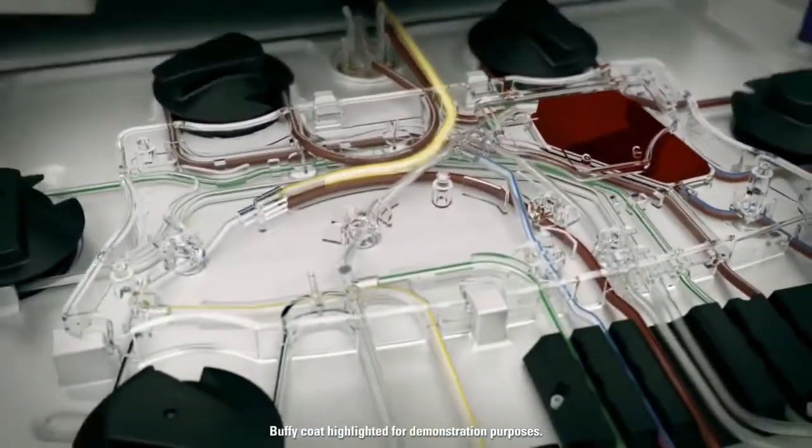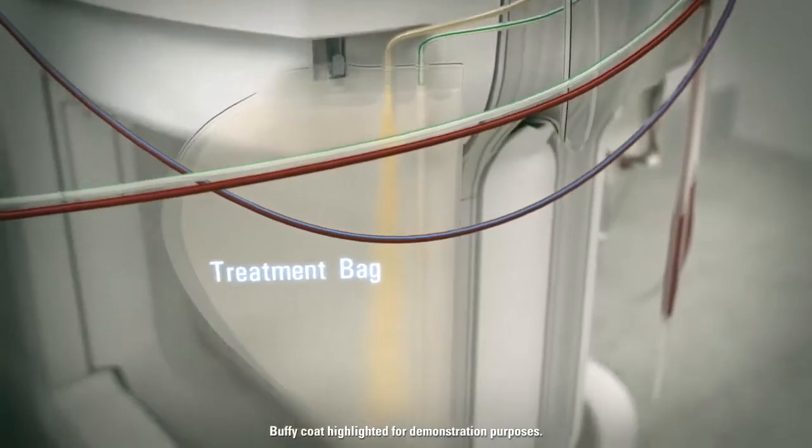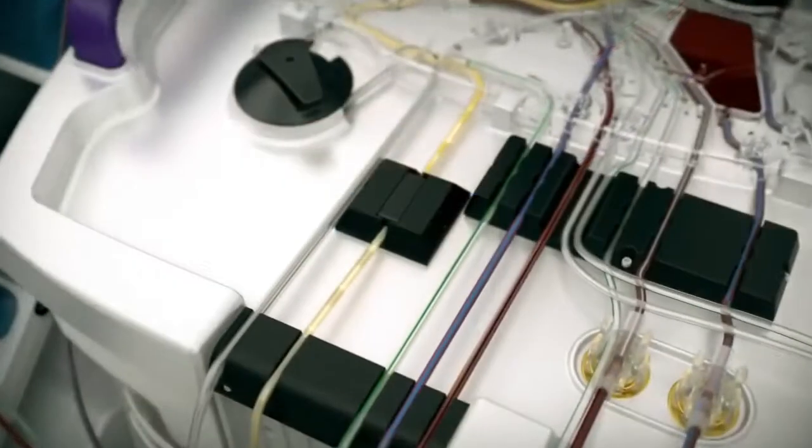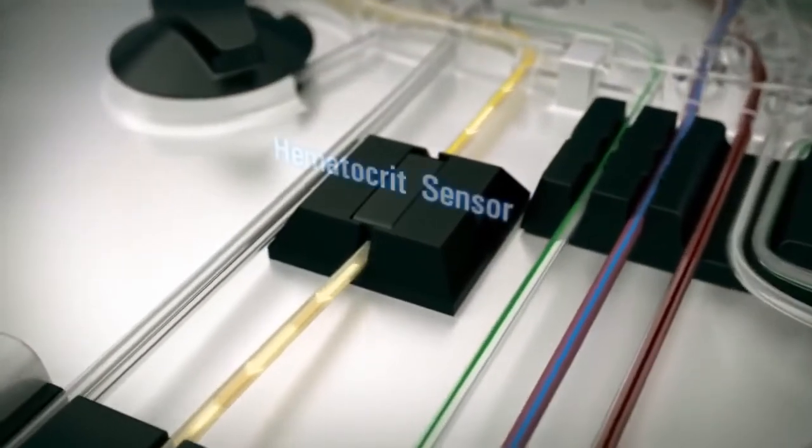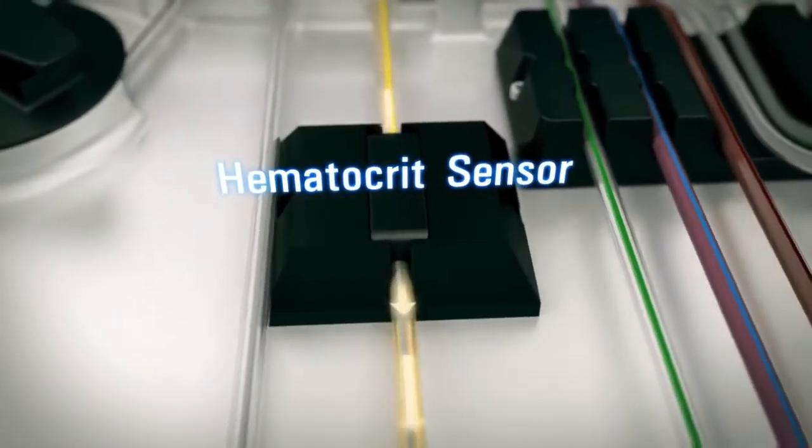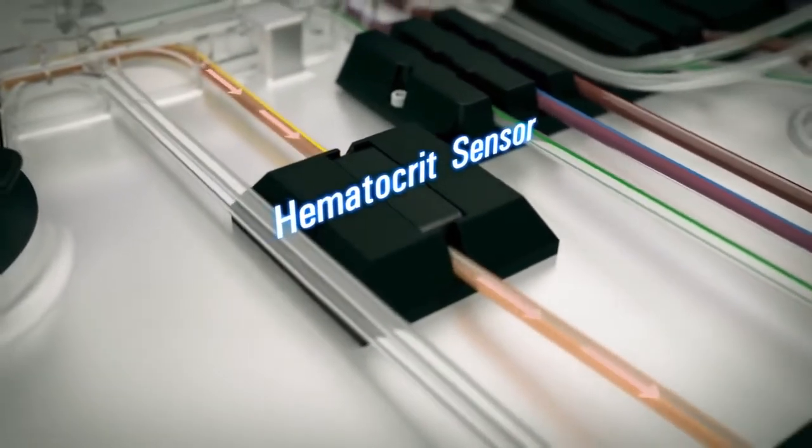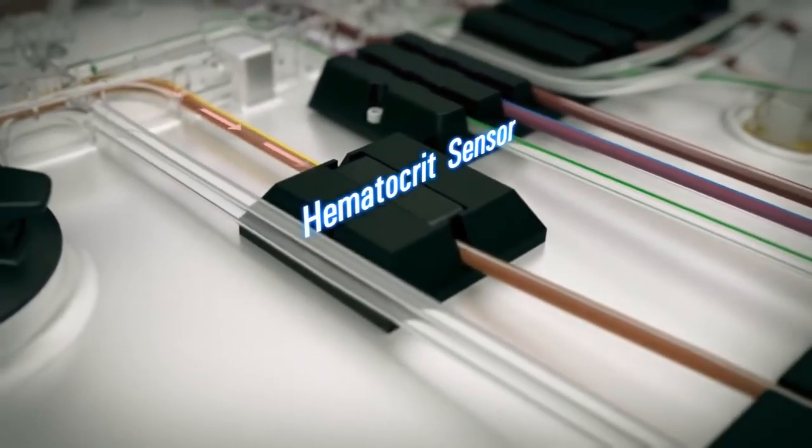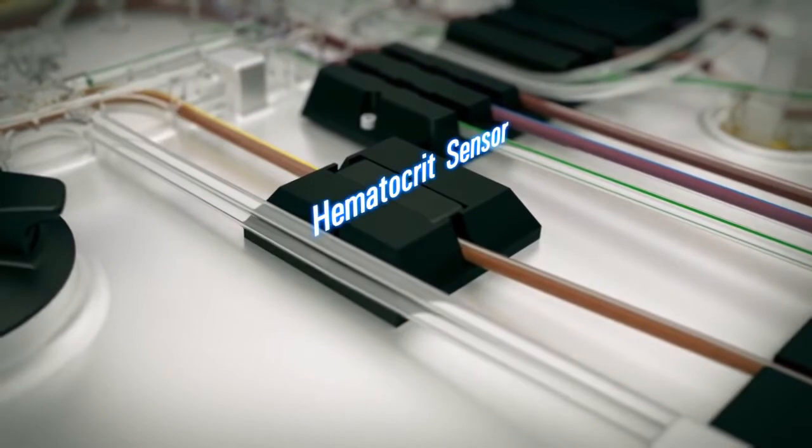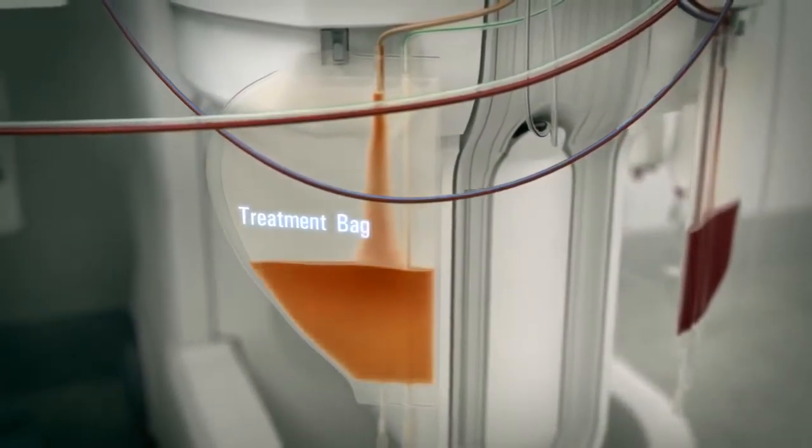The harvested buffy coat is transferred to the treatment bag. As the harvested buffy coat is transferred, it passes along the Celex system instrument deck through the hematocrit sensor which is able to detect the red blood cell concentration. Once the appropriate concentration of RBCs is detected, the tube is occluded and the removal of cells from the centrifuge stops in order to prevent additional RBCs from entering the treatment bag.